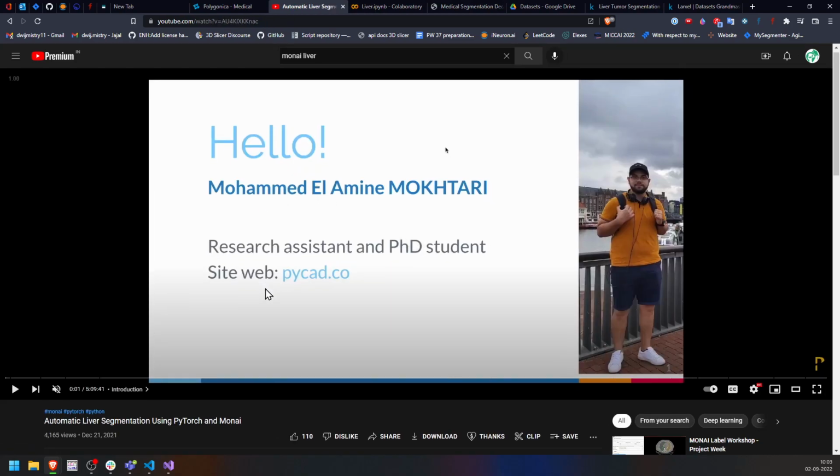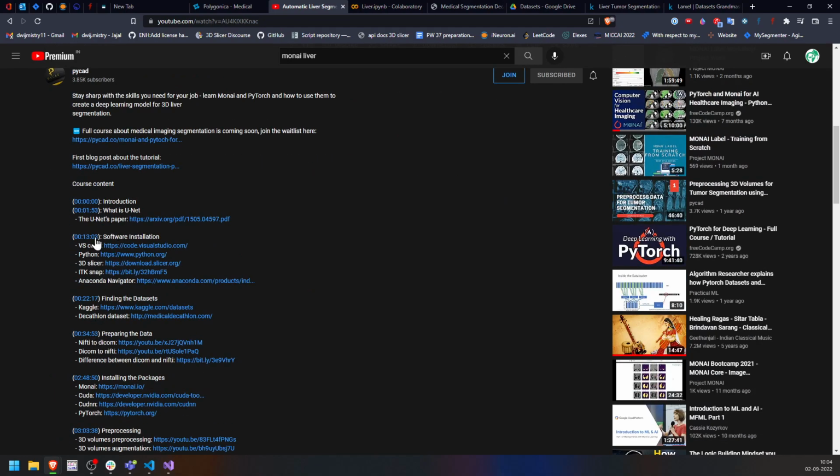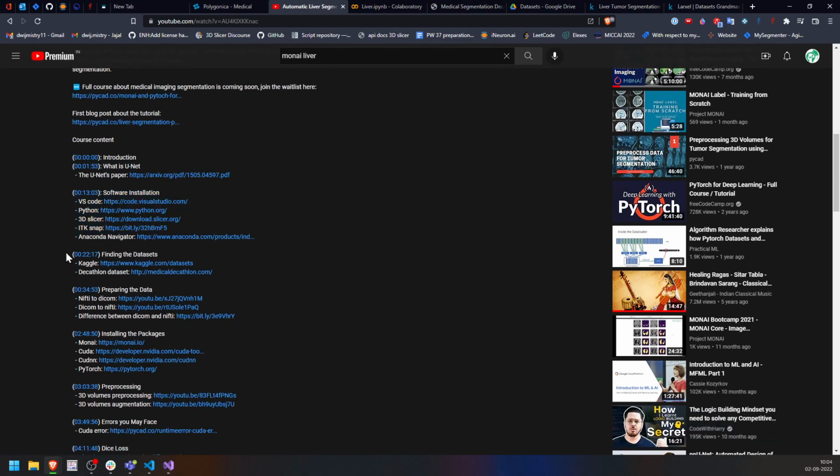The length of this video is around 5 hours, so there's no need to watch all of it. As you can see, the first part is the introduction, then what is UNet. Then the software installation is not required because we are going to use Google Colab. Then this is important: finding the data set.